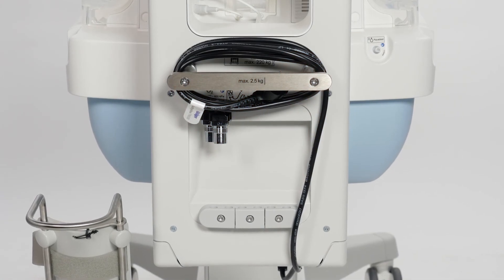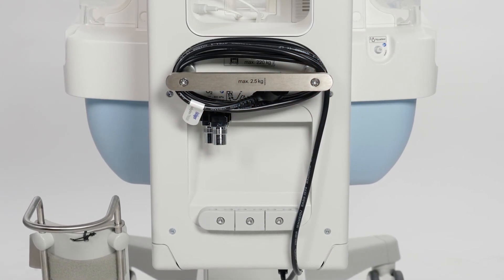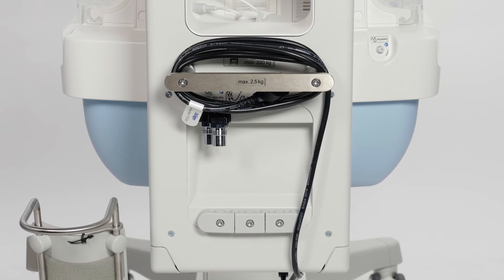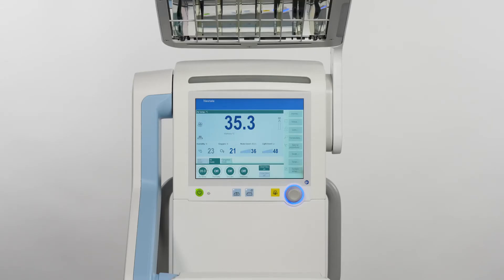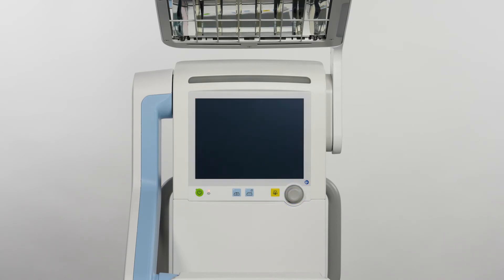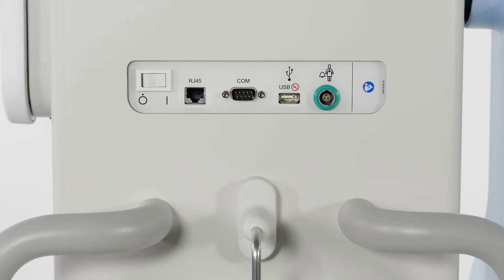For safety and security, we recommend that you fasten the power cable to Baby Leo by wrapping it around the rail to avoid accidental injuries. It is important to note that a power failure alarm will occur if Baby Leo was not switched off the official way, for example by only disconnecting the mains plug. Turn the main switch to the off position to stop the power failure alarm.